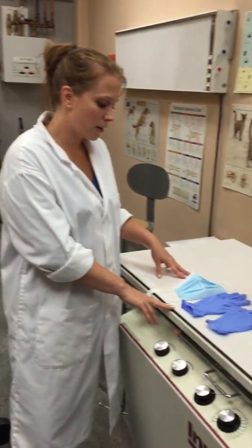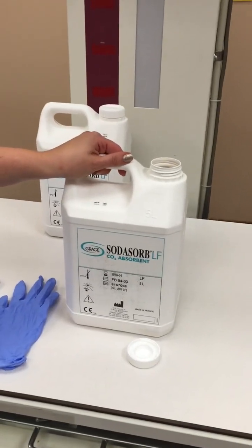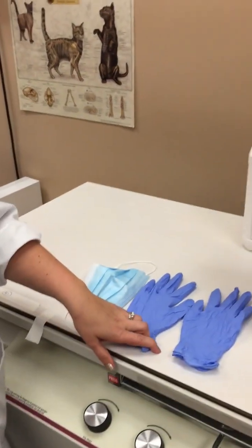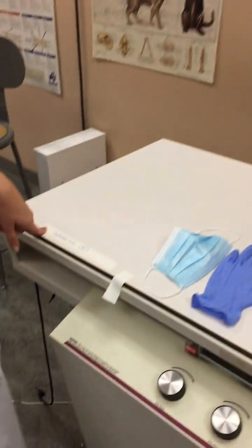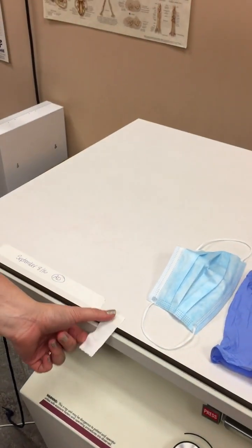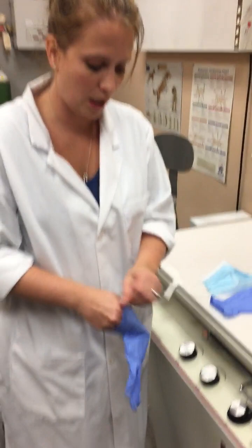Here on the table are the supplies that you will need to safely change the canisters. I have the soda lime granules that you can find in the treatment room in the cupboard underneath the front counter. I have a pair of gloves, a respiratory mask, a pre-labeled piece of tape with the date that it's changed and my initials. And then there's this extra spare piece of tape that is required for only one type of canister, which I will demonstrate shortly. So I'm going to get my supplies on.